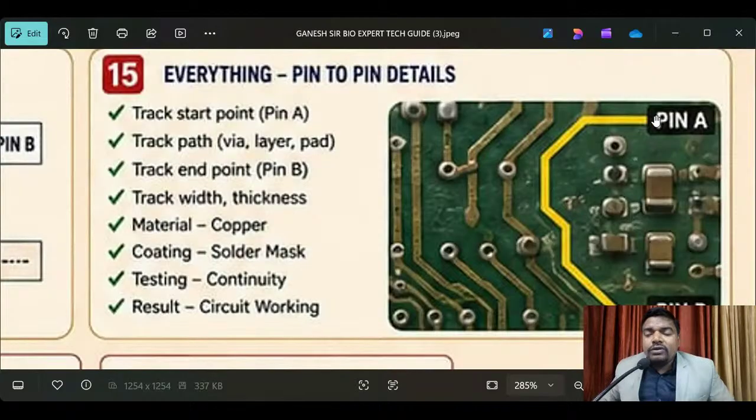So yeah, you have to check it and find out, and you should have that much capability for that purpose before you touch this equipment. You have to read the manual. Circuit manuals will be there, and based on that you have to find out. These are the time-taking and challenging tasks for every biomedical engineer. Understand? I hope you got it very clearly about what I'm saying here.